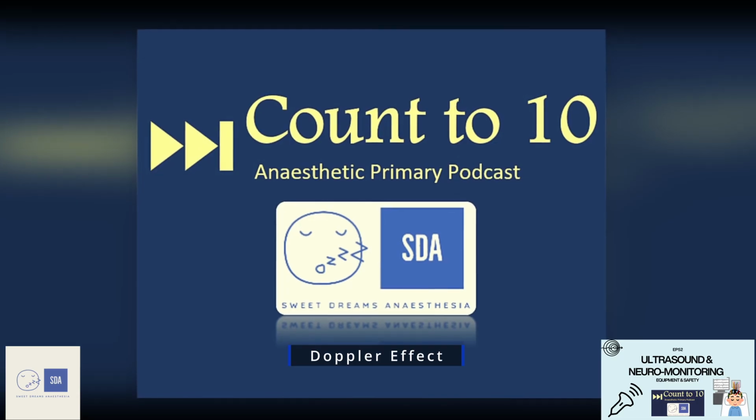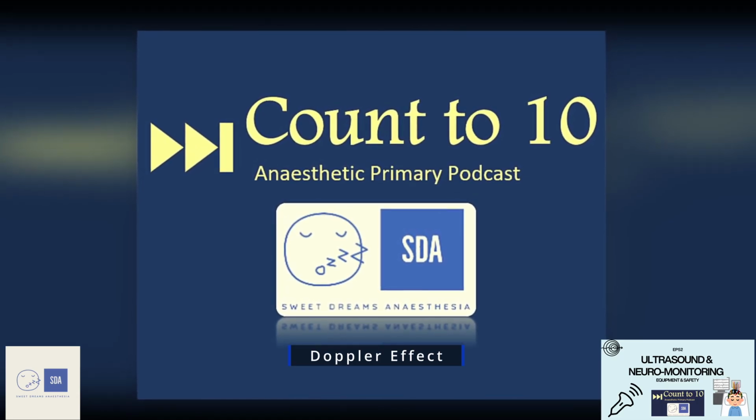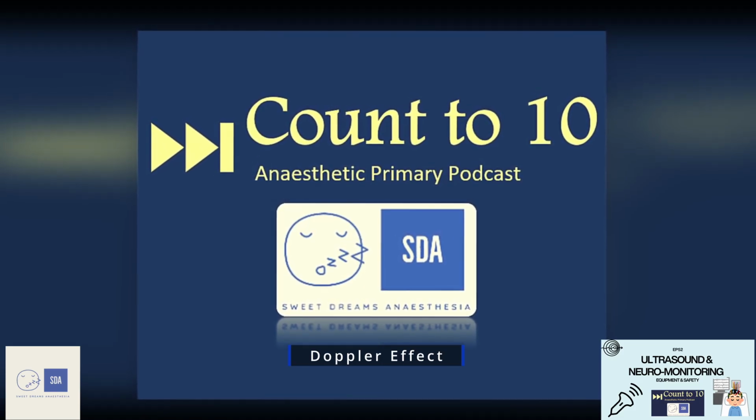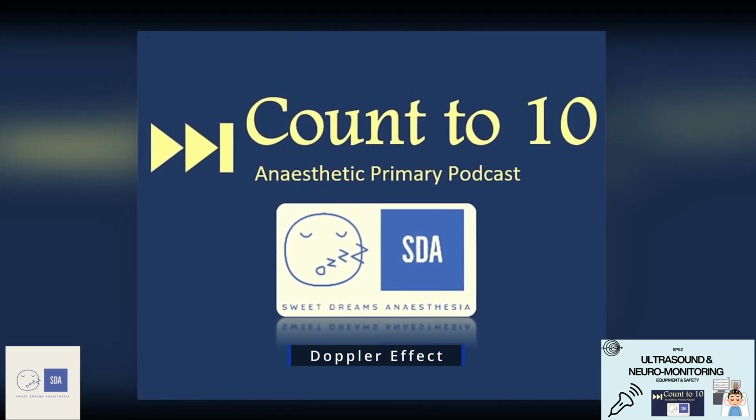And while that's really useful, the big negative of M mode is because of that single scan line, you don't get that global image. So each one of these modes has its own role to play. And with that, going back to Doppler mode, to understand Doppler mode, we first have to understand the Doppler effect.